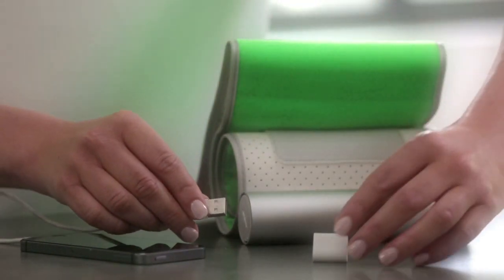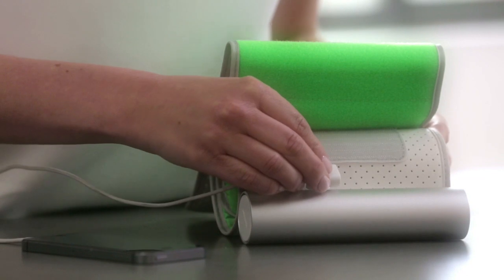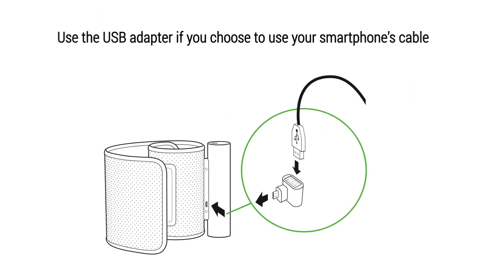The wireless blood pressure monitor works via Bluetooth, but it can also be used with your smartphone's cable. Plug your smartphone's USB cable to the adapter.